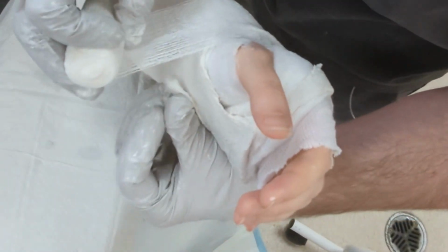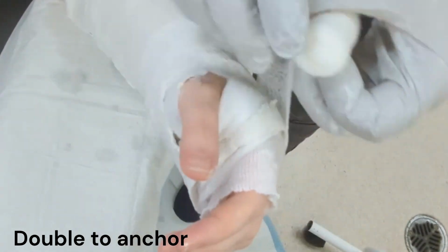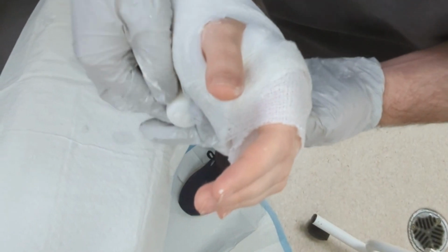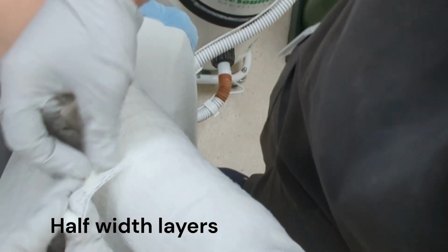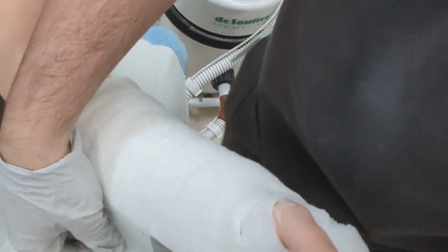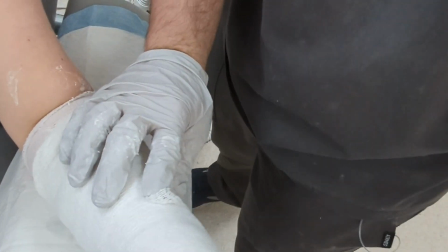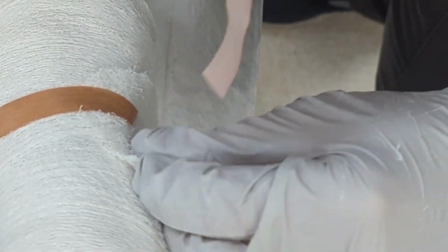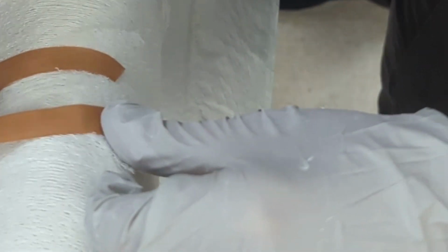When bandaging, just like soft band, ensure to double layer the first bit to anchor. Then wrap the bandage around the cast firmly and tightly to ensure the cast stays in place. Again, just like soft band, ensure when bandaging, half the width of the bandage crosses the next half. This keeps it tight and neat. We then move on to taping. When taping, use the tape to pull the bandage tight. This keeps everything in place.